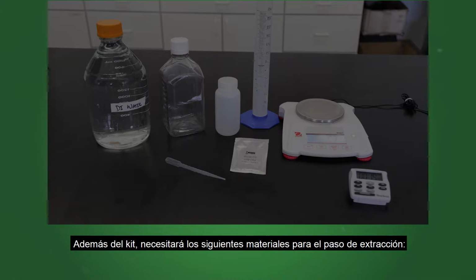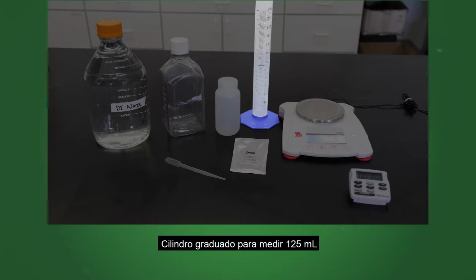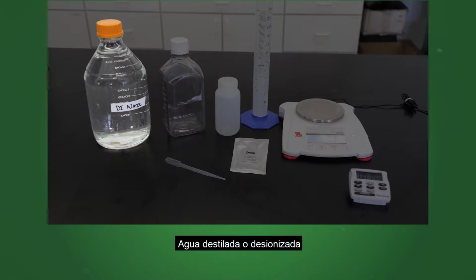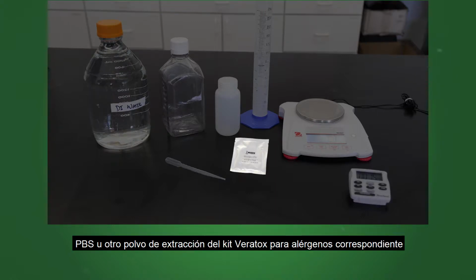In addition to the kit, you'll need the following materials for the extraction step: a shaker water bath capable of heating to 30 or 60 degrees Celsius, a graduated cylinder to measure 125 milliliters, a scale to weigh a 5-gram sample, a 1 liter bottle to prepare extraction solution, deionized or distilled water, a timer, and PBS or other extraction powder from the respective Veratox allergen kit.